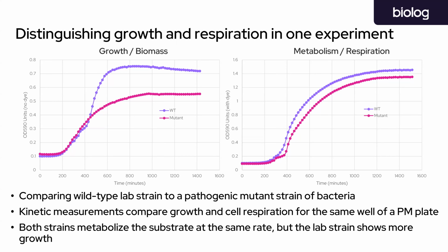So this is really an interesting finding. There's lots of examples out there that show that growth can be impacted, but you can persist and maintain metabolism. Some microbes have preferred food sources for doing things like making their cell wall that they need to divide. And the inverse can be true too. We know that there are cases where organisms can undergo a metabolic shift without changing their growth rate.